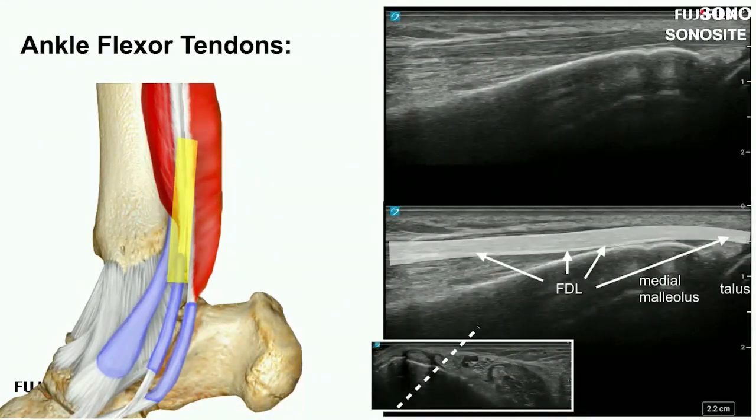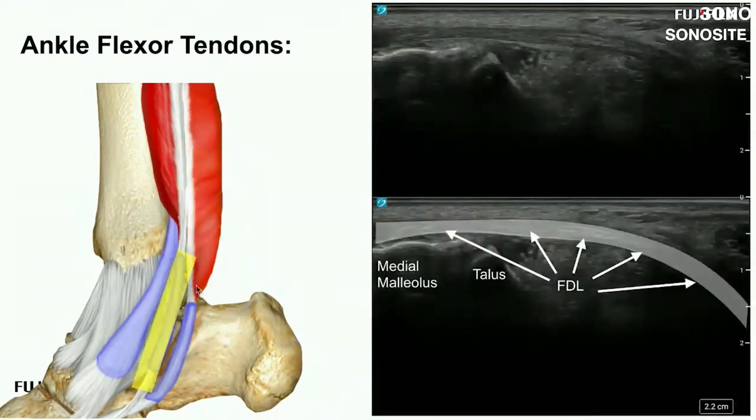Next, immediately posterior to that, go back up to your posterior tibialis tendon and then translate the transducer in parallel fashion posteriorly, and you'll catch the flexor digitorum longus. Then wiggle the rest of the digits, the smaller toes, to make this tendon isolate itself. Medial malleolus, talus is coming into view. Let's go distally and see what happens after the medial malleolar level, because that's where all these tendons go their different directions. Again, wiggle the little toes, and we'll do that in a live study.